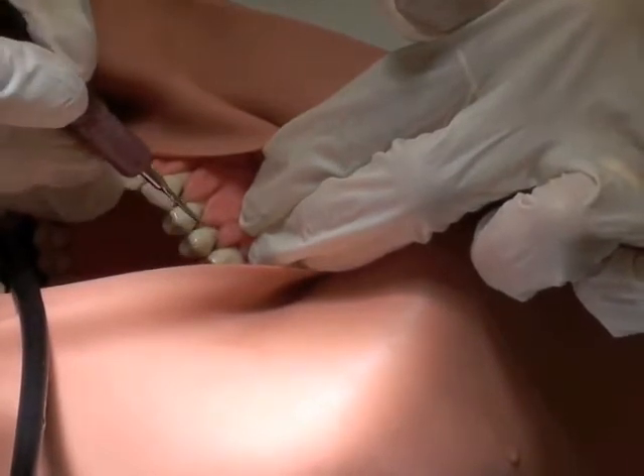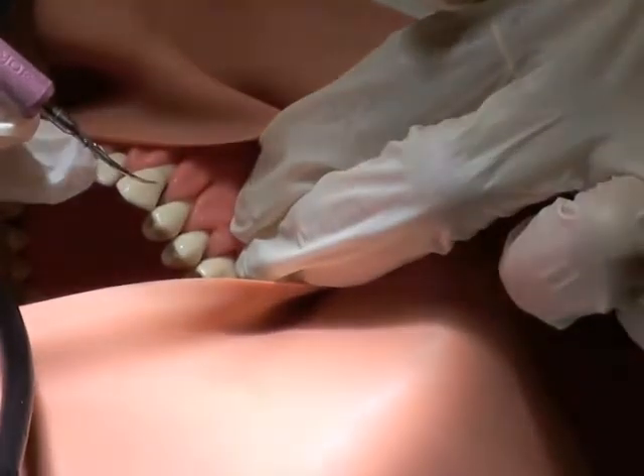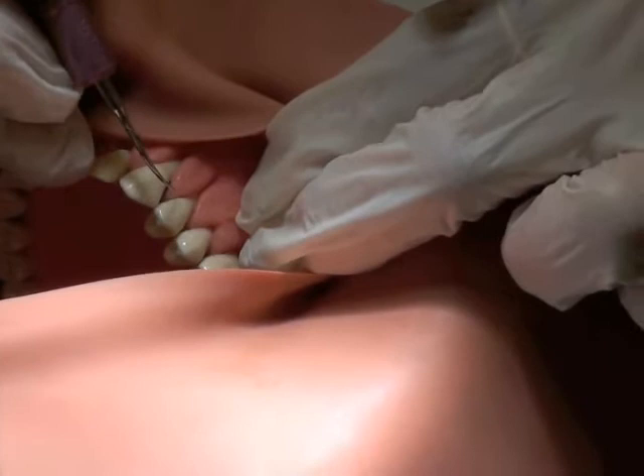We kind of want to trace the tooth, trace the area we're going to be working in. We want to activate the water before we enter the sulcus. That makes it easier, kind of lubricates the sulcus.